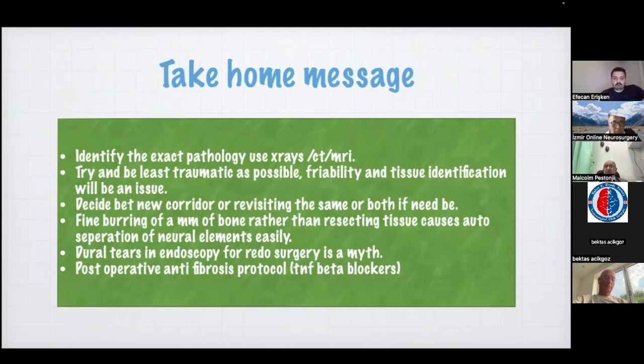You have to decide between the new corridor and revisiting the same or both new corridors. Fine burring of 1 millimeter of bone rather than resecting tissue causes auto separation of the neural elements very easily. Dural tears in endoscopy for redo surgeries for me has been a myth. I've done a few hundred of them now, my own and from others, wherever the sources of patients coming seeking relief. But redo surgeries, I've had 0 dural tears. So for me, it's a myth.